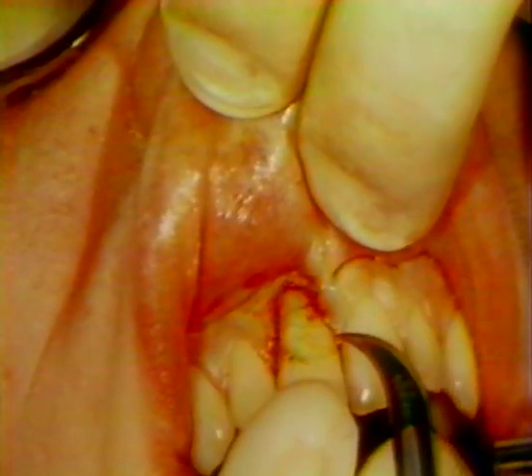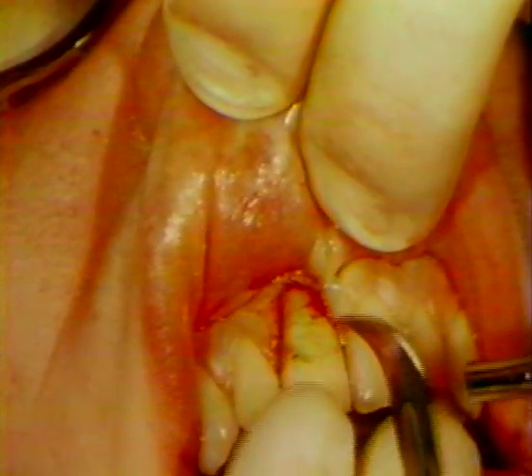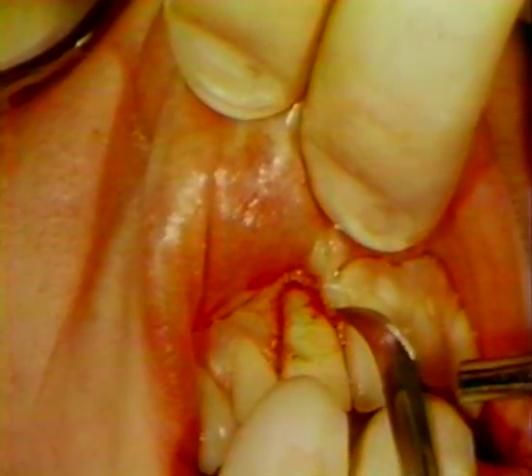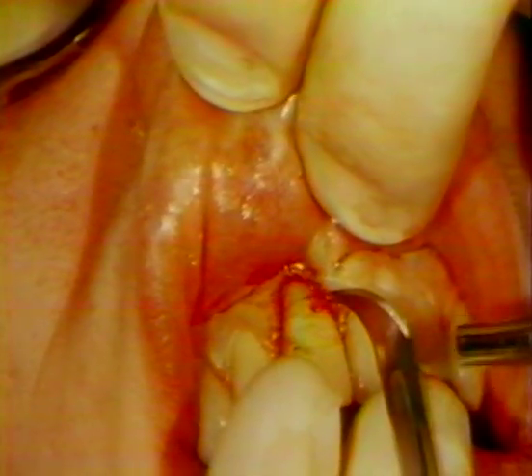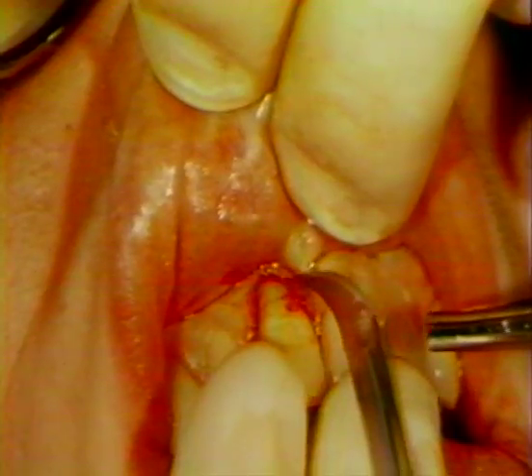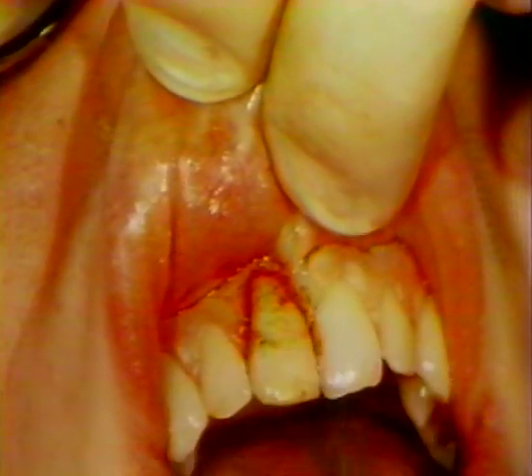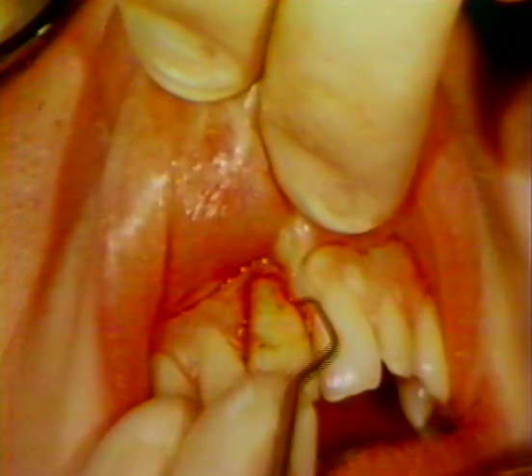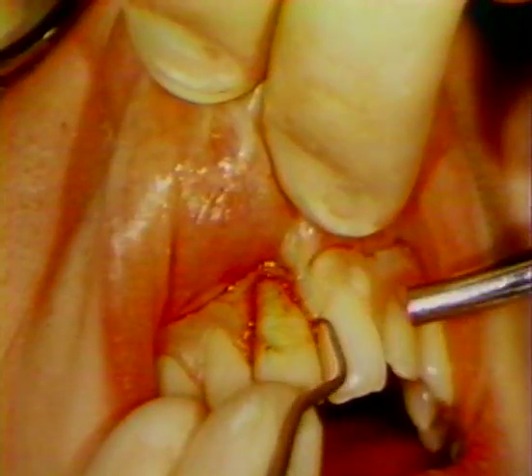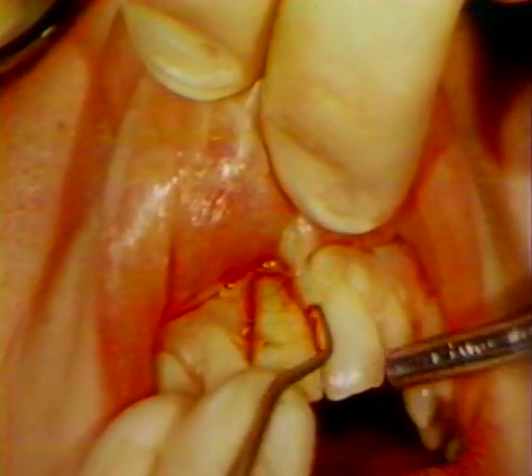The remaining mesial portion of the gingival crevice is now excised. This area is also curetted to assure complete removal of the epithelium.